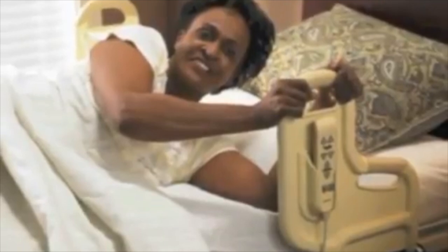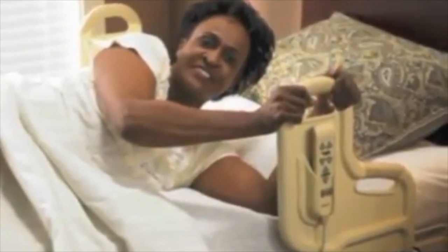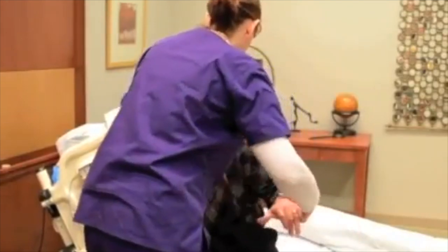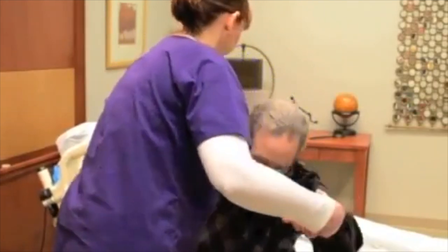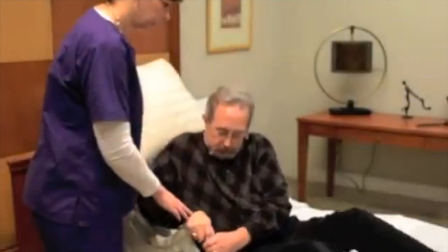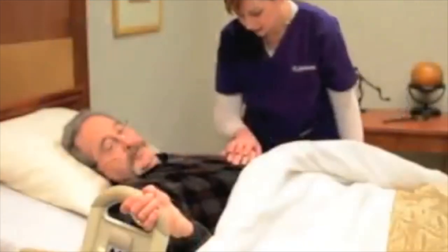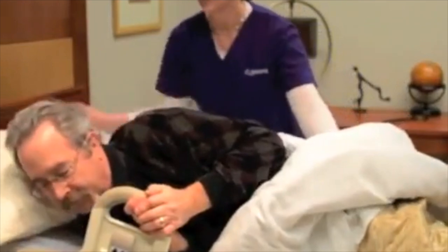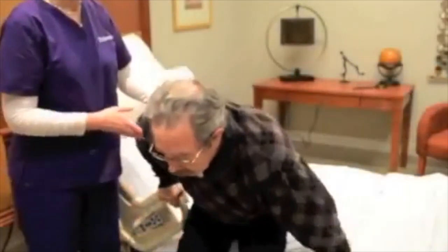Many residents require some assistance to move in bed or to get out of bed. The assistance required can vary greatly depending on the resident's capabilities and condition. Assist devices mounted onto bed frames can provide a secure handle to grasp for residents to reposition themselves or to push themselves to a standing position.